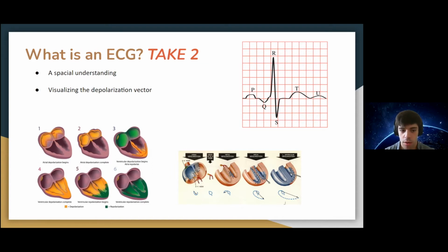And ultimately, the ECG is a projection of something called the depolarization vector. Doctors don't actually have to understand the depolarization vector because it's a whole lot more complicated than just understanding the patterns. They might as well just learn the library, absorb a huge database of ECGs, and that's a pretty safe bet for understanding how sick a person is or what disease someone might have.